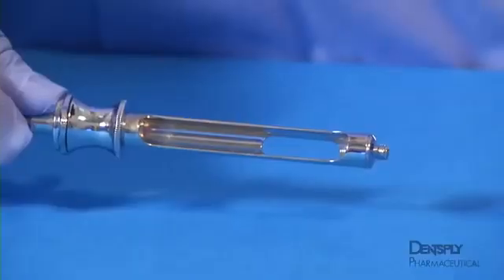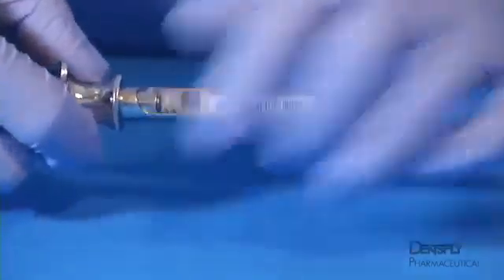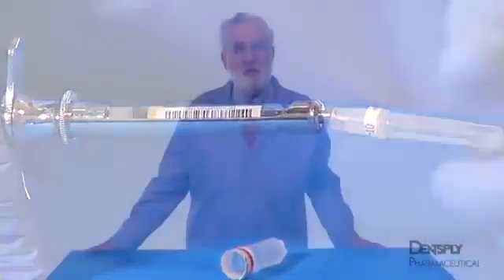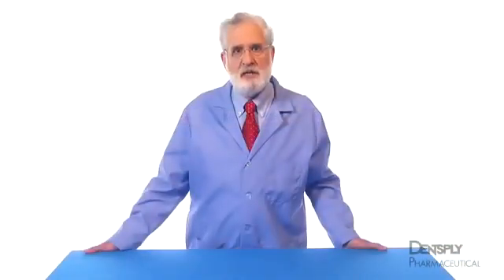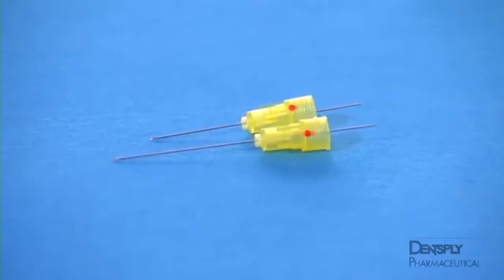When used correctly, the single-dose cartridge, sterile hypodermic needle, and aspirating syringe combine to ensure accurate placement of the local anesthetic solution with minimal risk to the patient. For most maxillary blocks, the 25-gauge long needle is generally preferred. When the depth of needle insertion is less than 2 centimeters, the 25 or 27-gauge short needles are suitable alternatives.